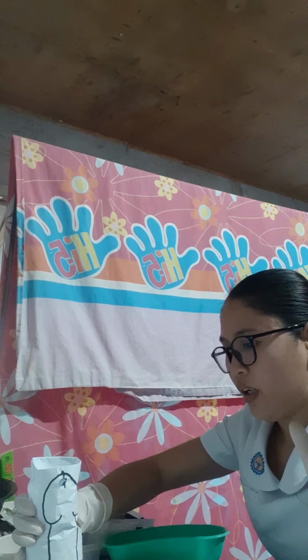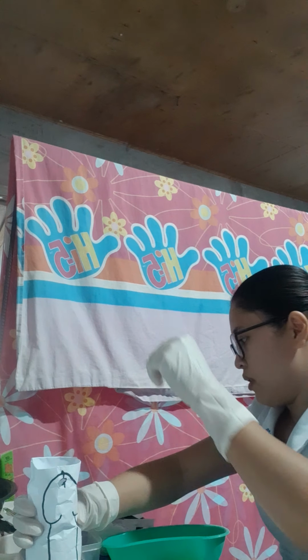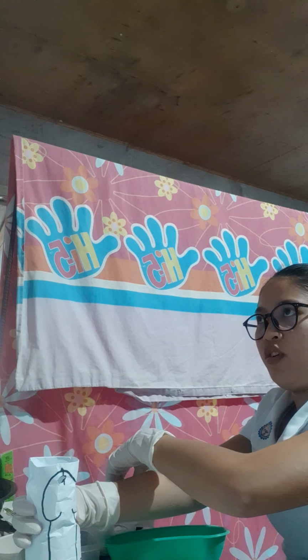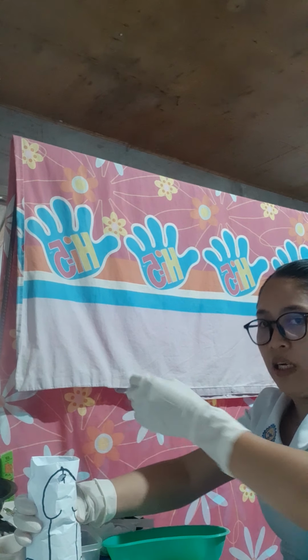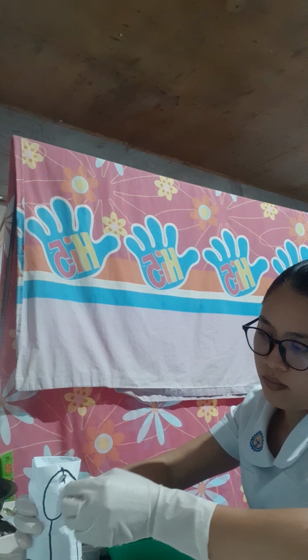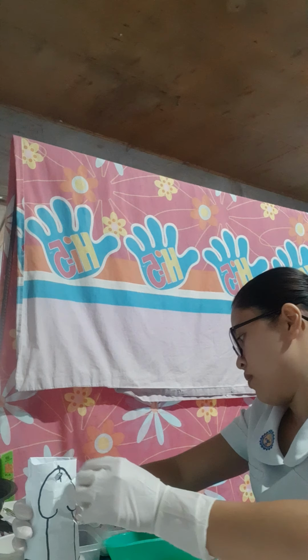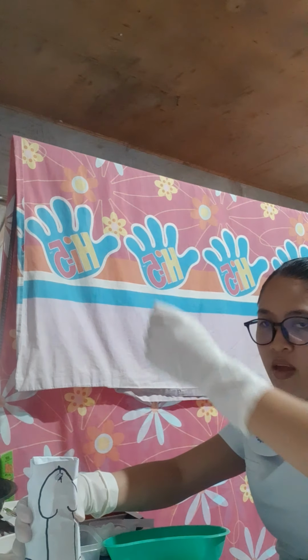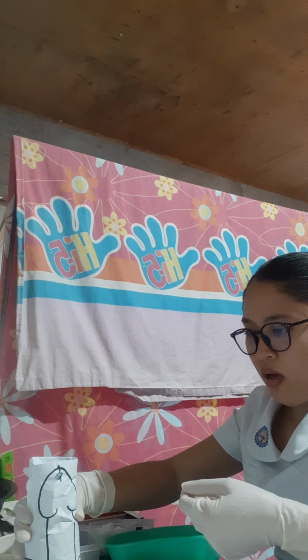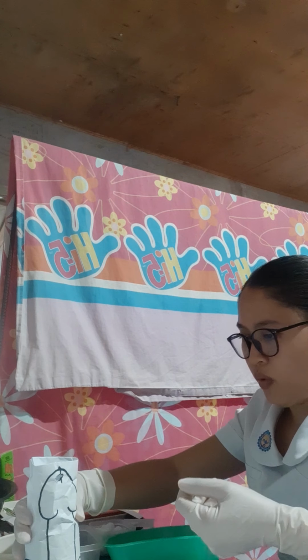With the dominant hand, pick up cotton balls and clean the penis. Move in a circular motion from the urethral meatus down to the glans. Then we're going to do it 2 times using clean cotton balls each time.